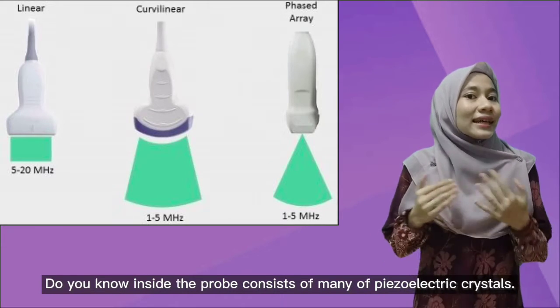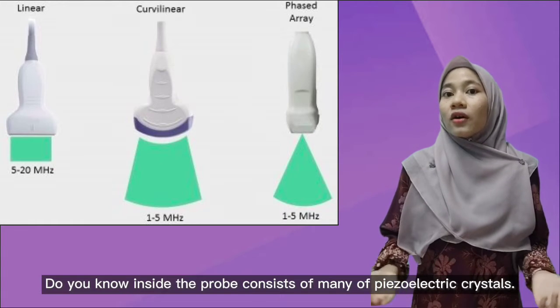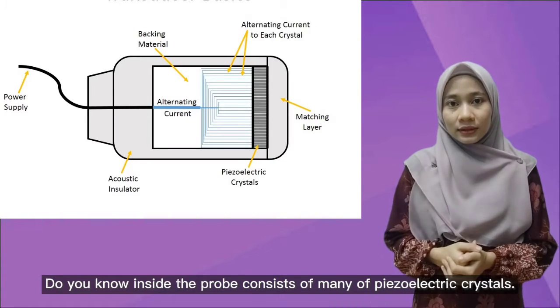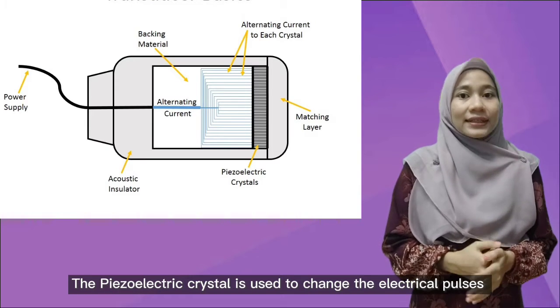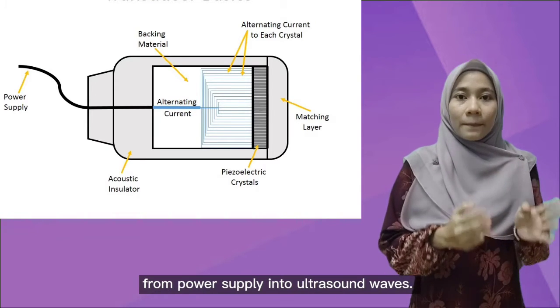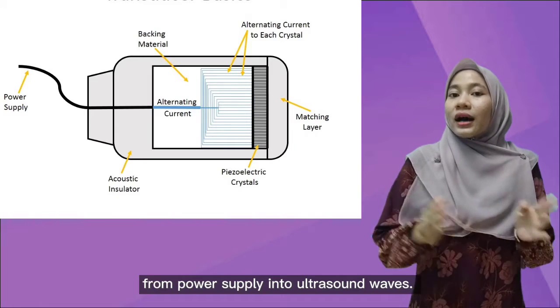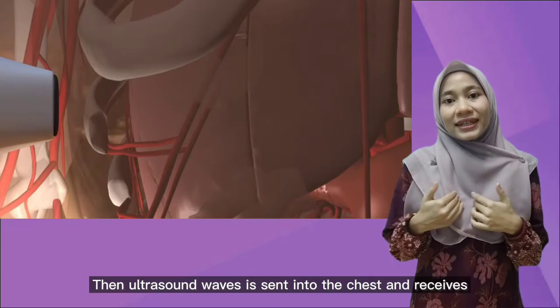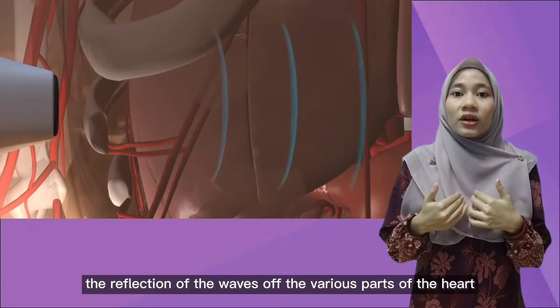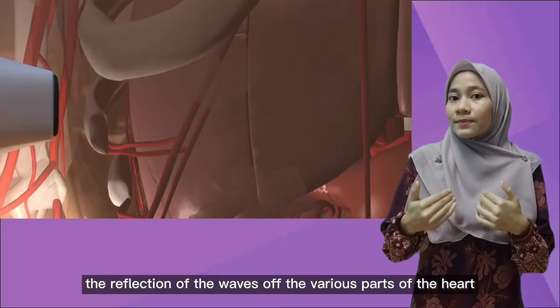Did you know the probe consists of many piezoelectric crystals? The piezoelectric crystals are used to change the electrical pulse from the power supply into ultrasound waves. Then the ultrasound is sent into the chest and receives the reflection of the waves from various parts of the heart.